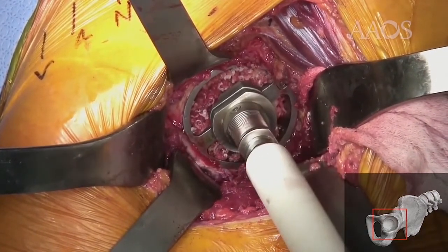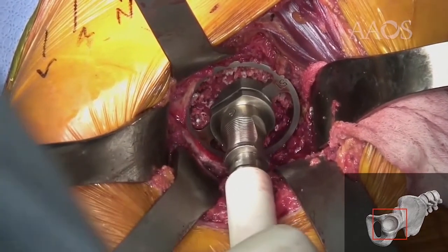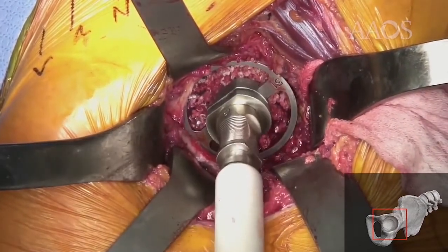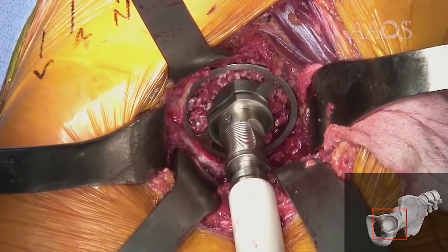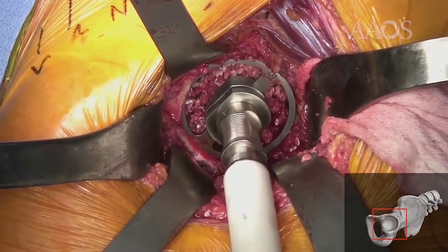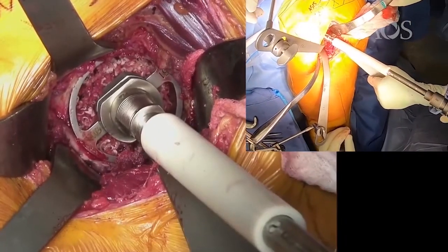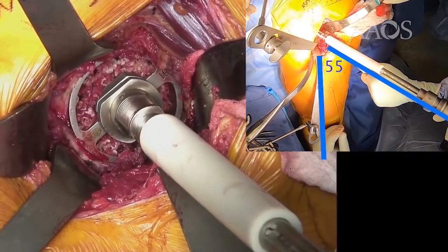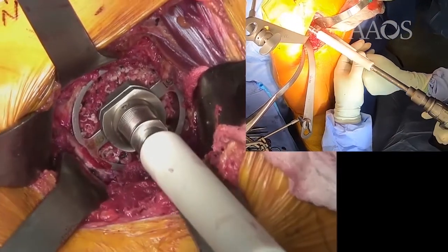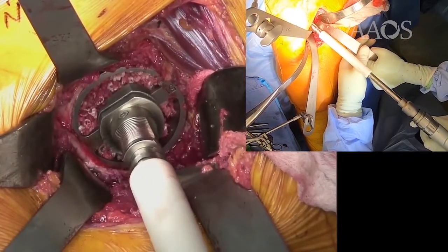In doing so, the lateral acetabular rim becomes exposed, and the reamer falls just below it, indicating a proper abduction angle. In a similar manner, we can move in version anteriorly and posteriorly so that the reamer aligns itself with the transverse ligament to recreate the anteversion angle.